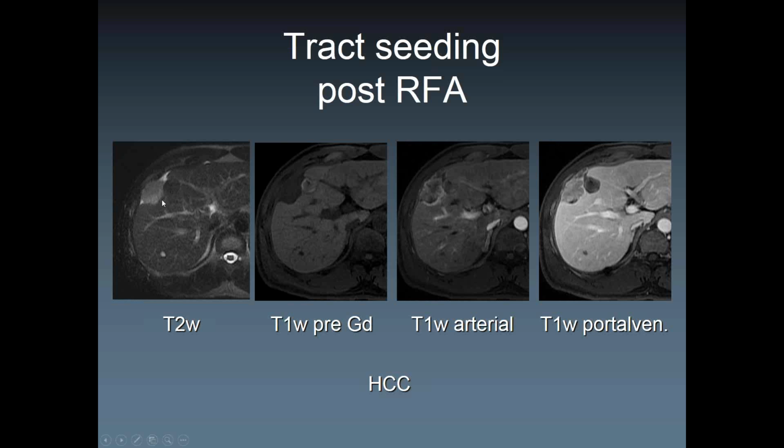This one here is the liver capsule, with a little bit of ascites around that, so that's an implant on the periphery of the liver, on the distal capsule of the liver right there. So it's a capsular seed, not a parenchymal tumor, right? And you can see with contrast that it is already obviously enhancing because there are microfeeders through the capsule that supply blood to that target there.